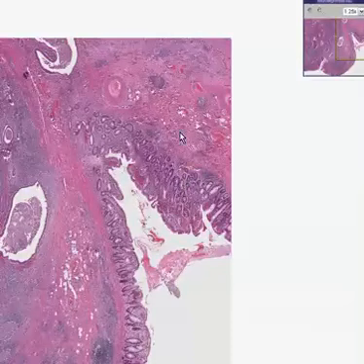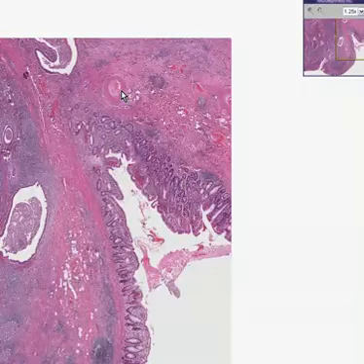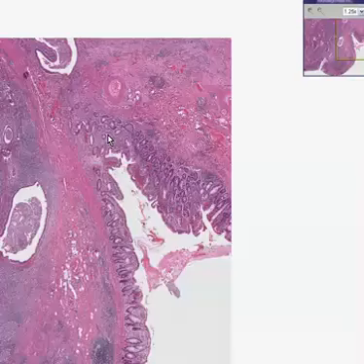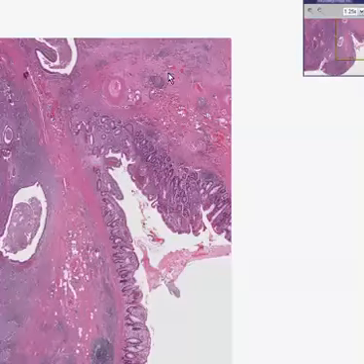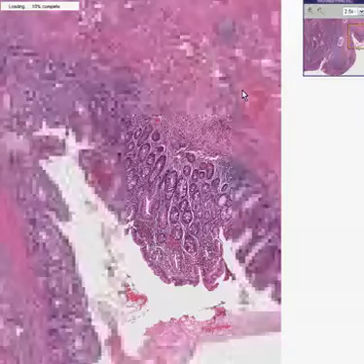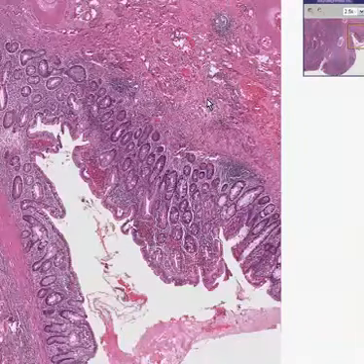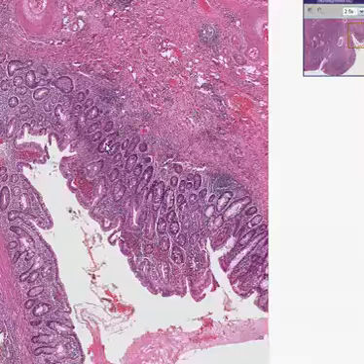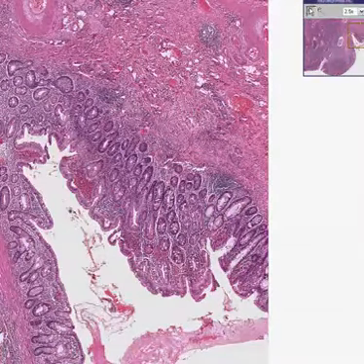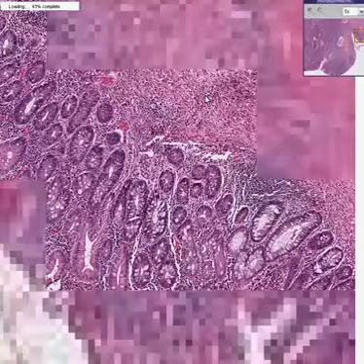This is a good place to start with our next case called ulcerative colitis, carcinoma, atypia. Here is a colon. Here's the mucosa. Here's the submucosa. Notice a couple of things. Number one, the submucosa and mucosa has a considerable amount of increased infiltrates of inflammatory cells.